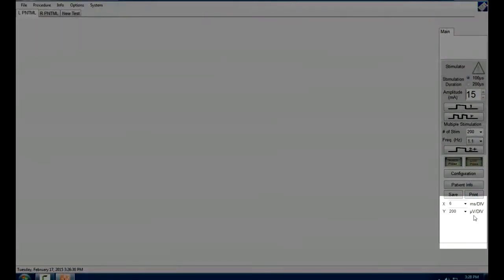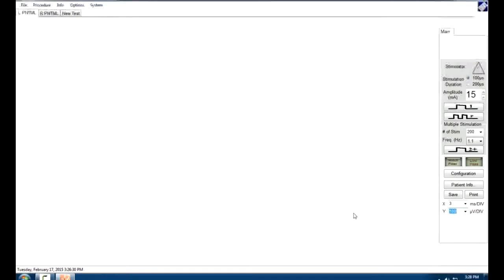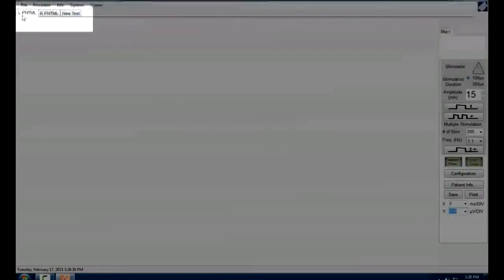I recommend over here for the XY axis to change the X axis to 3 and the Y axis to 100. You might even want to try 50, but for right now, let's just go with 3 and 100. Up here in the upper left-hand corner, you can see the left and the right pudendal nerve stimulations. By default, we always start with the left side, but you can choose either side that you want.